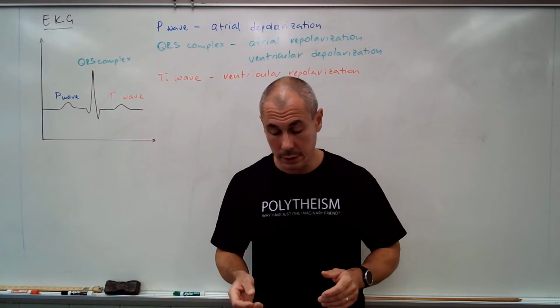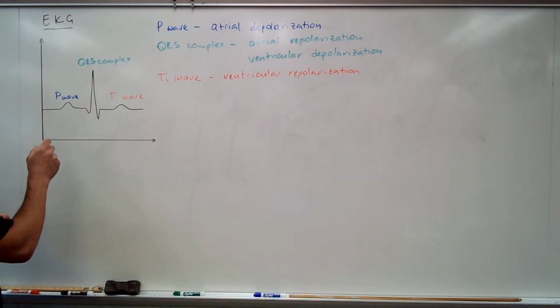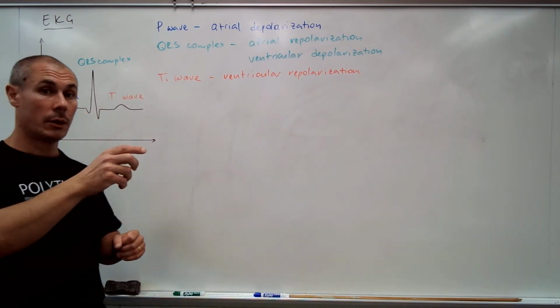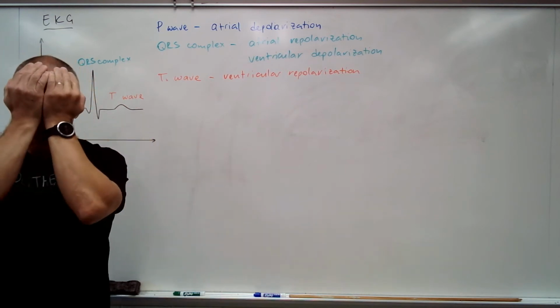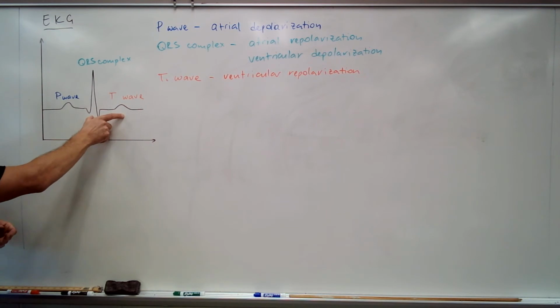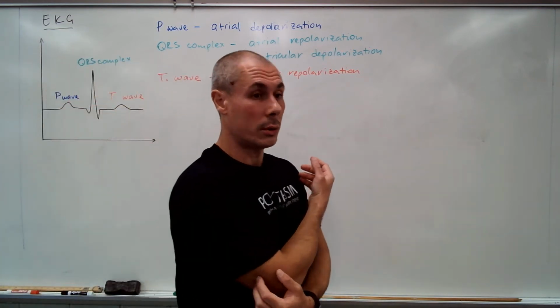We good? Okay. Or we can measure the QT interval, and that will tell you the time that... hang on a second, I'm thinking. QT or ST, one of the intervals. So the time that your entire ventricle is depolarized.